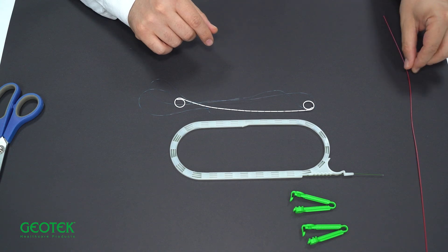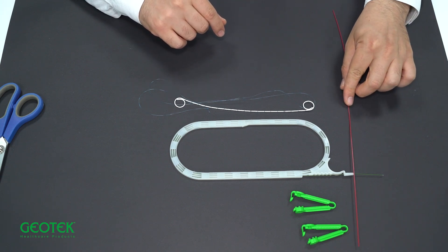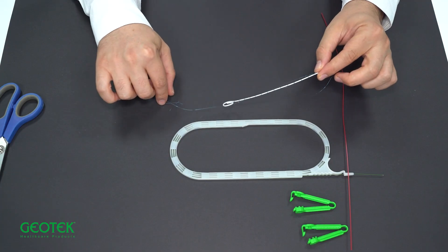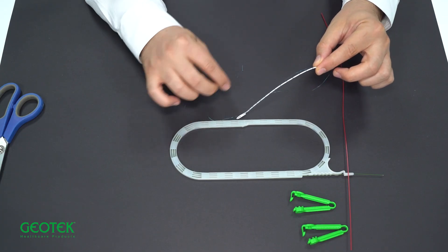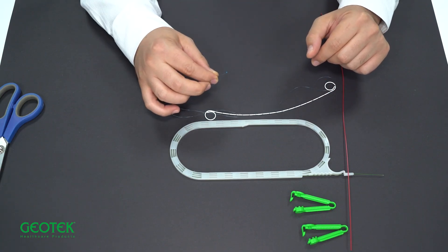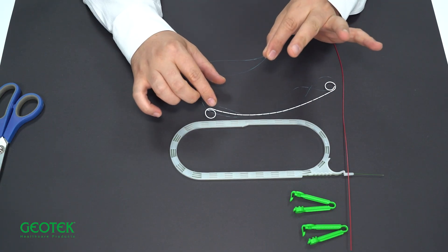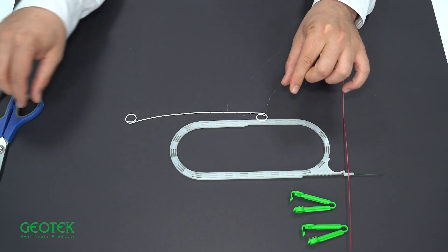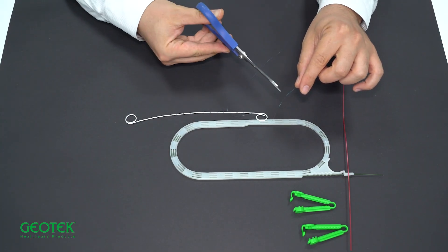In order to facilitate the use of double J stents in open surgery, a fixation suture is placed next to the double J stent. If endoscopic surgery is to be performed, you can remove the suture. When removing it, our recommendation is not to pull it off, but to cut it with scissors and pull out the remaining part.